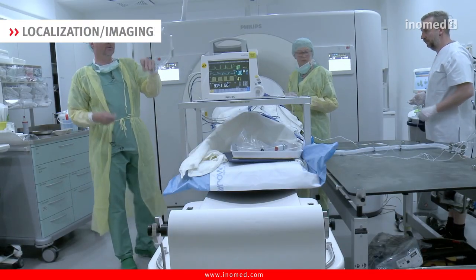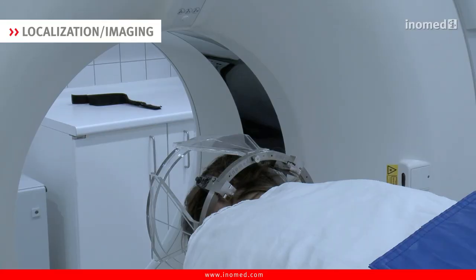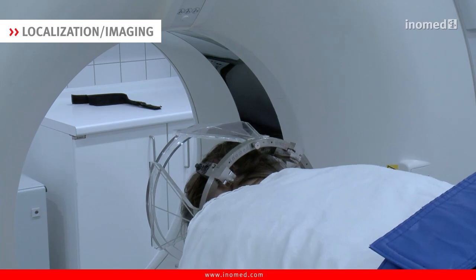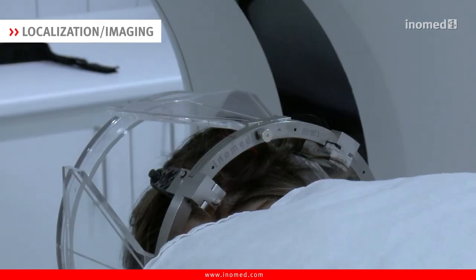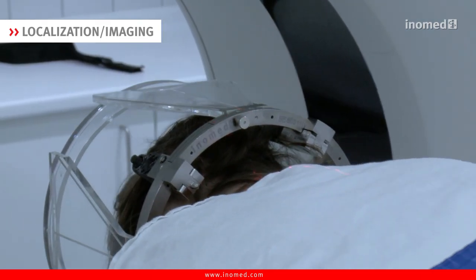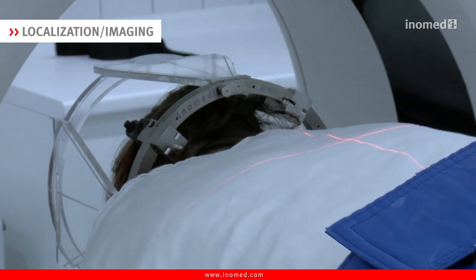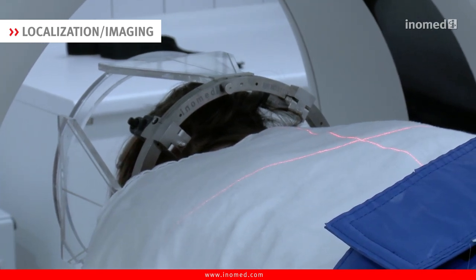The next step is to attach the localization set. This is required by the planning software in order to identify the position of the head within the ring in relation to the CT image.